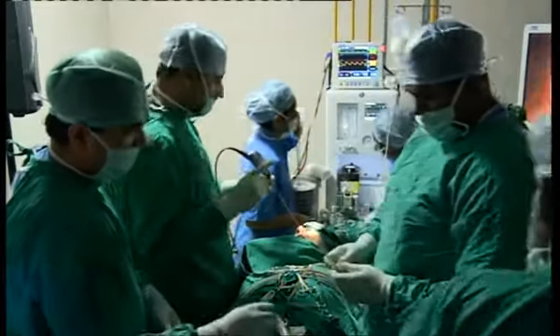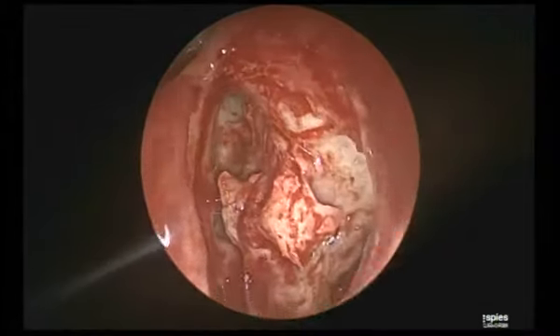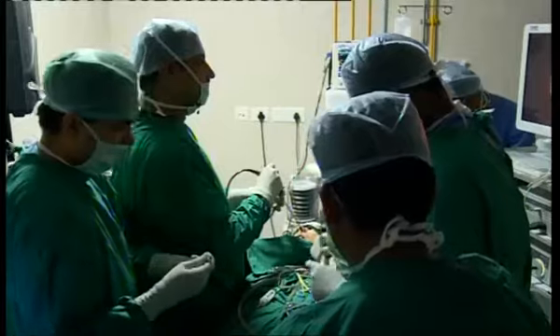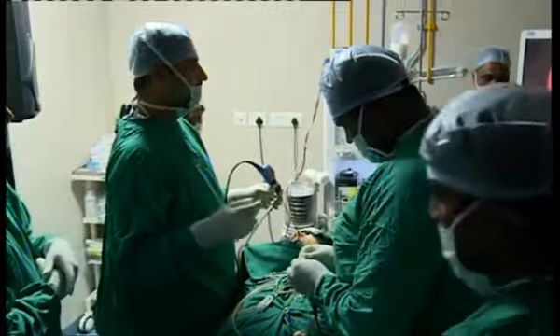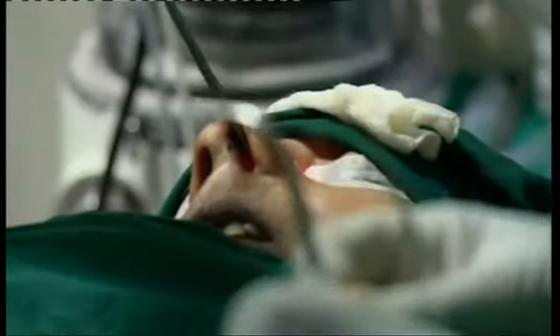So this bulla goes high up on the skull base. Ek minute, Satish. That external camera, some people want to see the stability of the scope. Just make that external camera, zoom in onto the PIP or something.